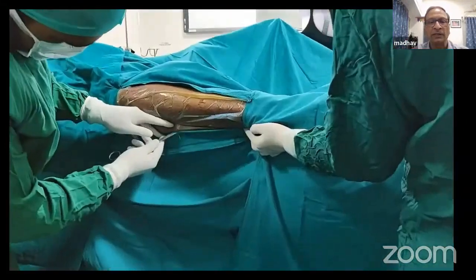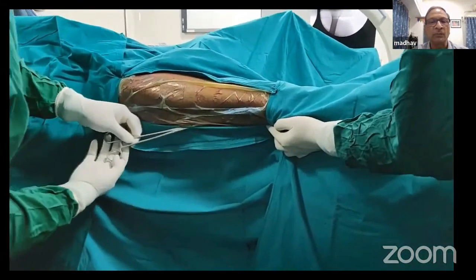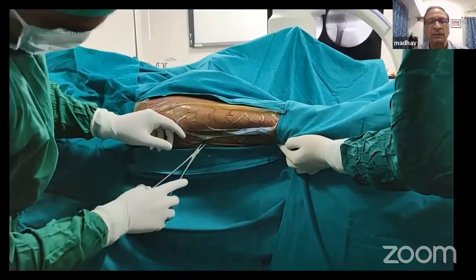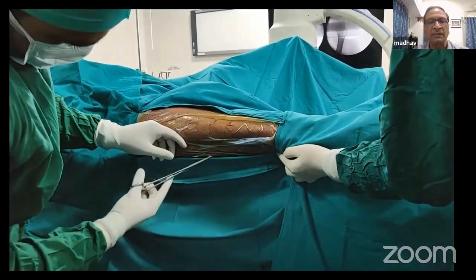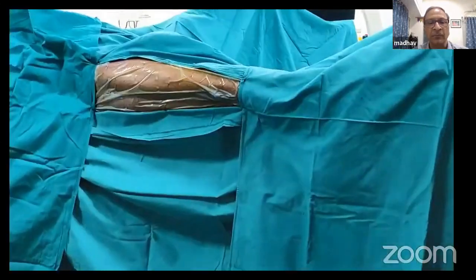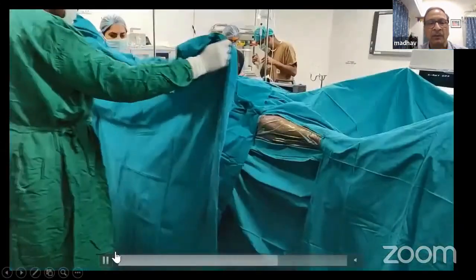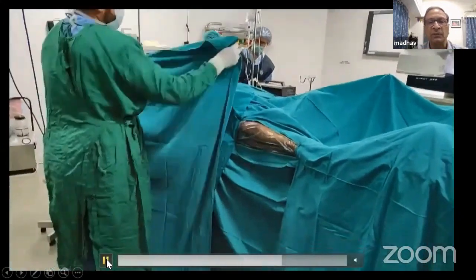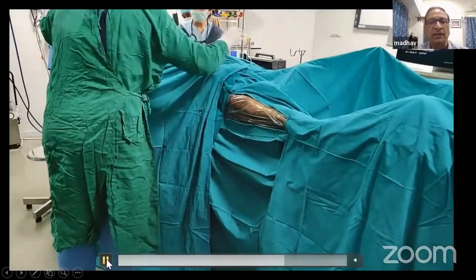This is so that they don't move or come out. As you can see, all the sheets have been secured.